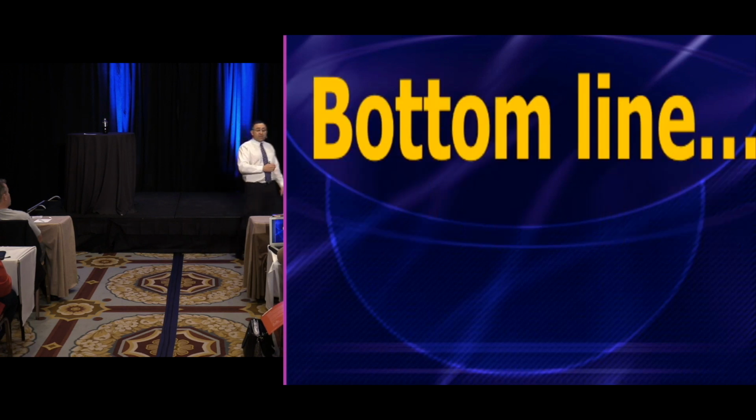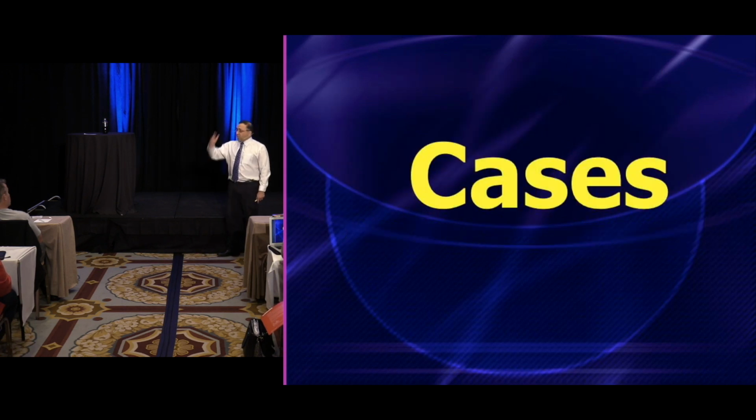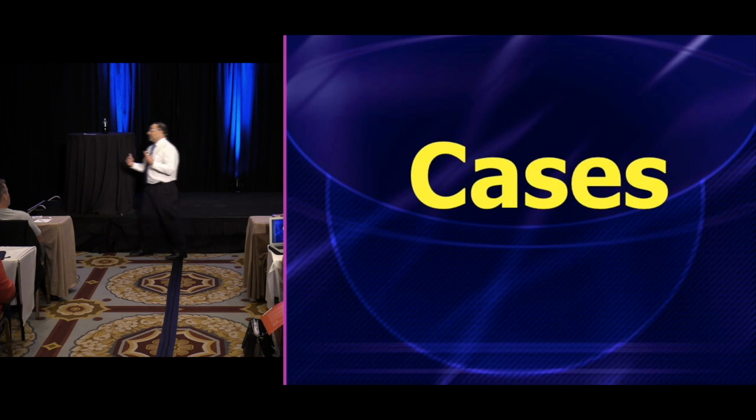All right? So what we're going to do for the next couple of hours, before and after our break, we're just going to do cases. We're going to do case after case after case, and I'm going to try to show you a lot of examples, and I invite you to ask questions. I don't have all the answers. If I don't have an answer, maybe somebody else in the audience does. If not, then I will do my best to find the answer for you and get back to you.